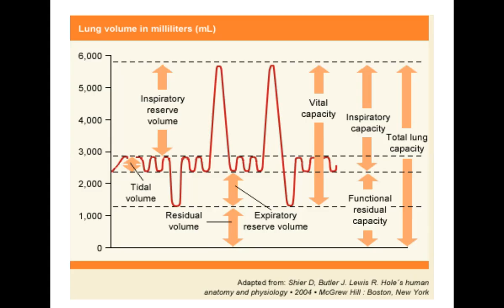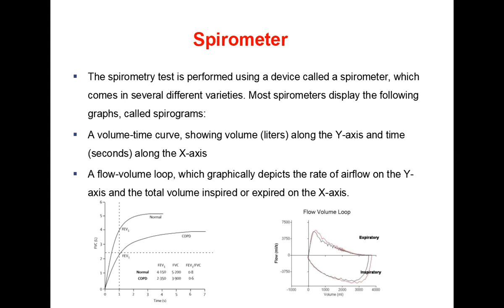So you can see that the spirometry values can vary with age, and the lung capacity can vary with age and sex.